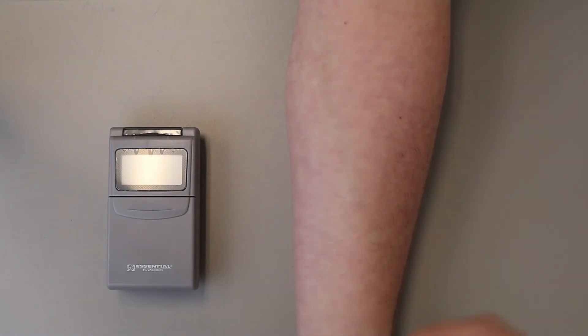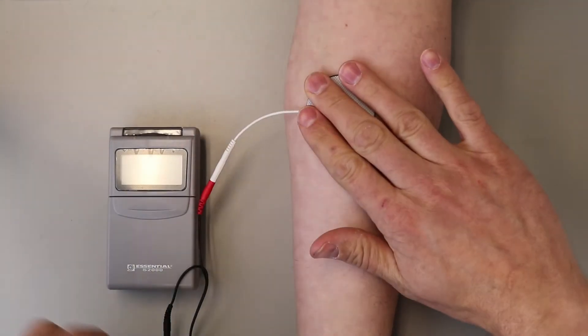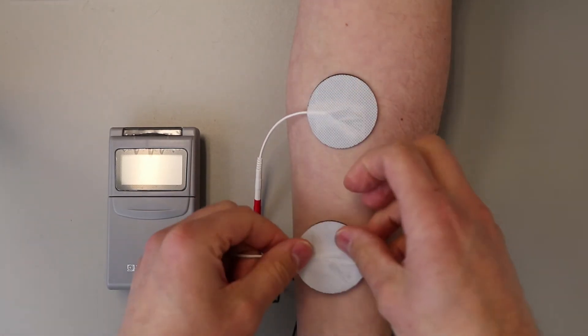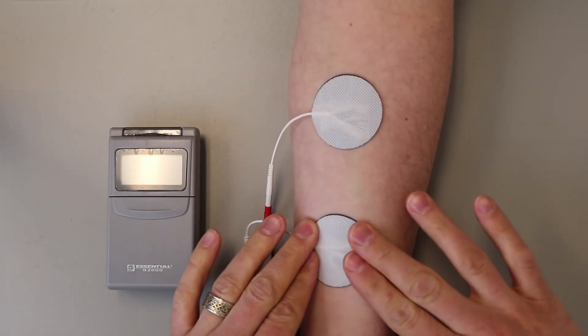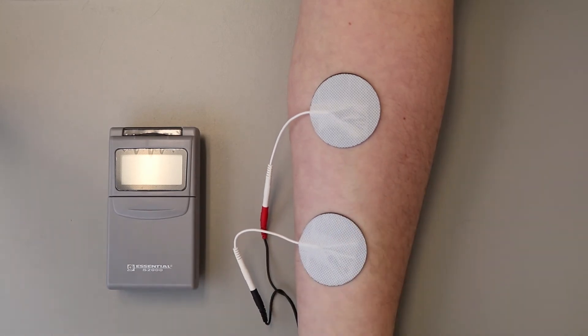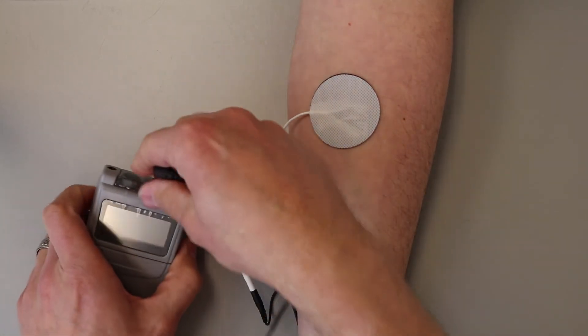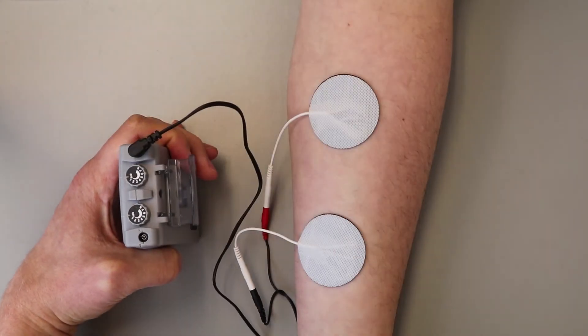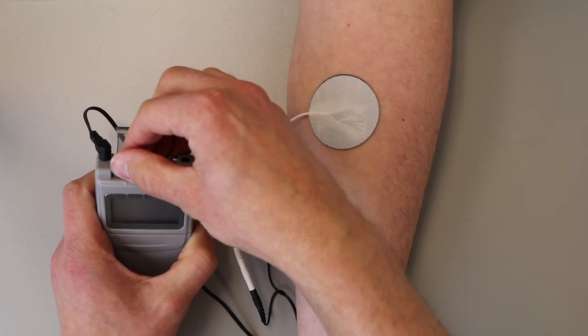Place the electrodes on the skin as recommended by your clinician. Plug the lead wires into the TENS unit, pushing in as far as it will go. Then adjust the intensity control as recommended by your clinician, and be sure to close the cap once it is set to the desired intensity.